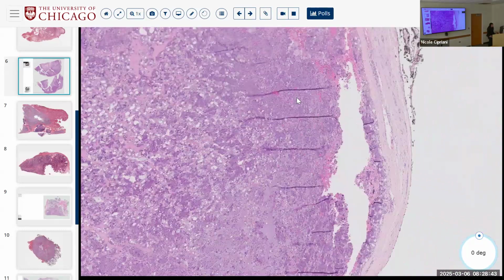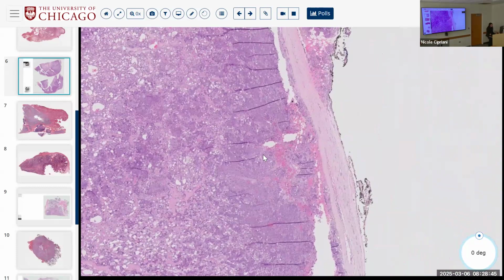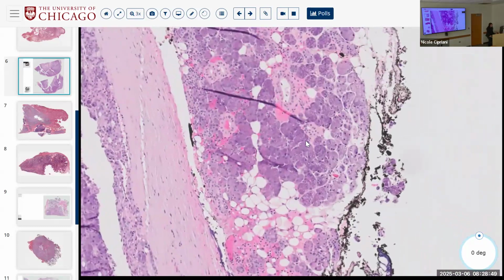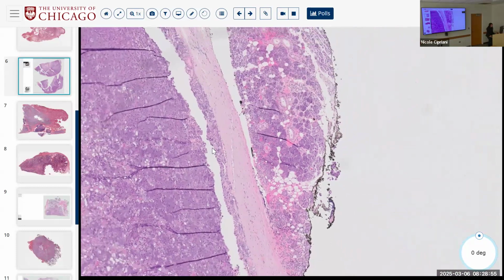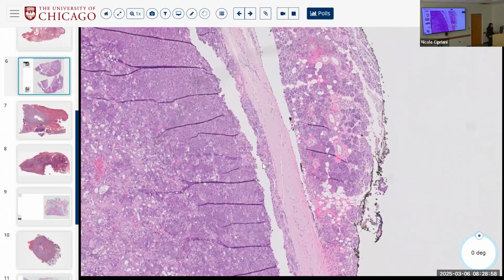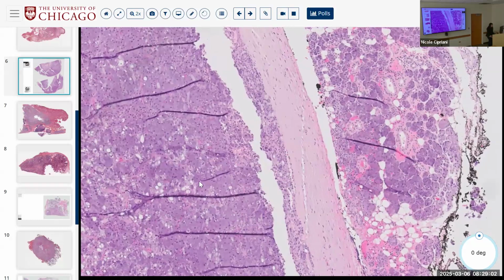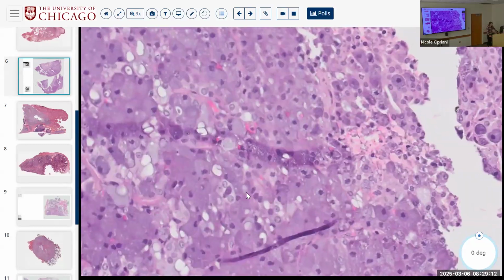Yeah, that was my only research. Yeah, I mean, that is an answer, exactly. So acinic cell, exactly, right, normal. So acinic cell basically only occurs in the parotid, showing acinar cell differentiation. You can prove that those are serous by either looking at H&E and seeing the zymogen granules, which we can very well see in this case.